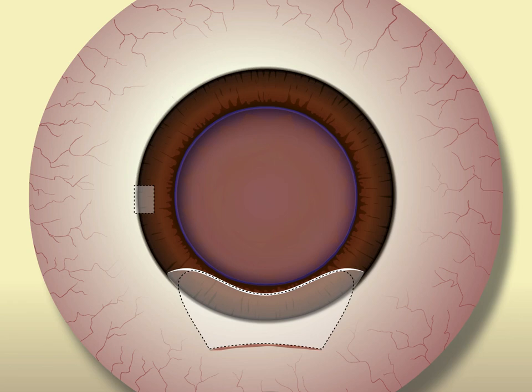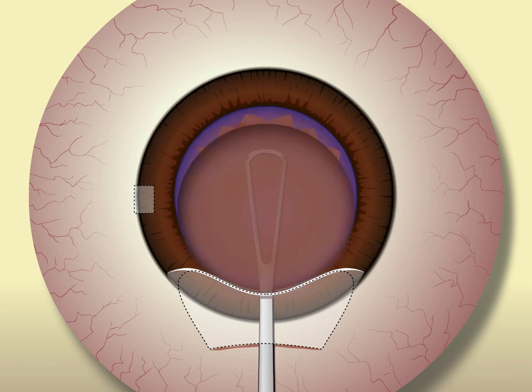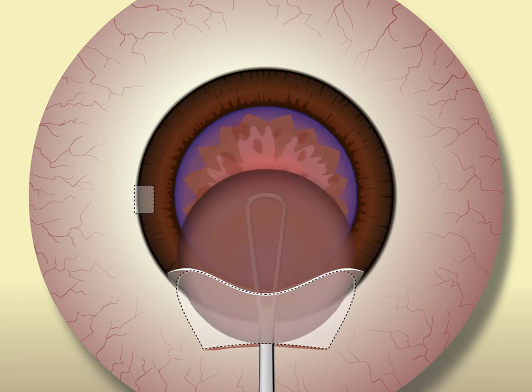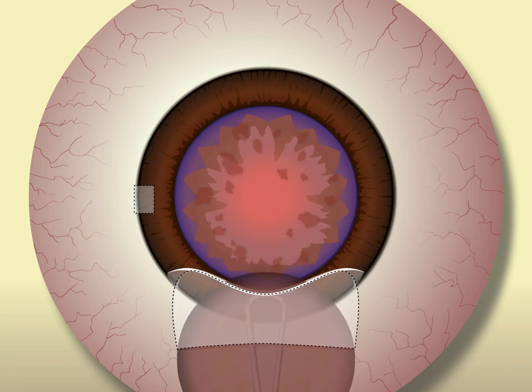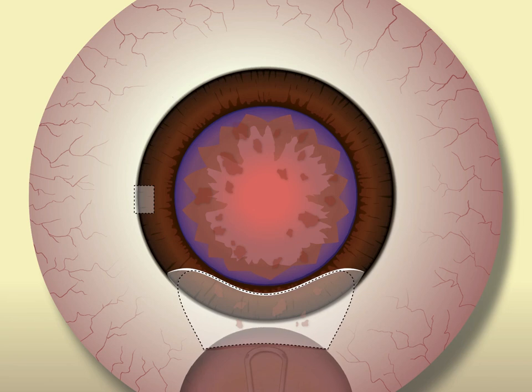The nucleus can then be safely removed either by using an irrigating vectis or a lens loop. A key point is to remember to press down gently on the incision as you extract the nucleus. This allows the nucleus to be removed from the anterior chamber without rubbing against the corneal endothelium. You will be inclined to lift up when extracting the nucleus at first — try not to do it. Also, if the nucleus can't be extracted with relative ease through the incision you have made, enlarge the incision. It's better to have to suture the incision than to try to muscle the nucleus out through an incision that's too small.